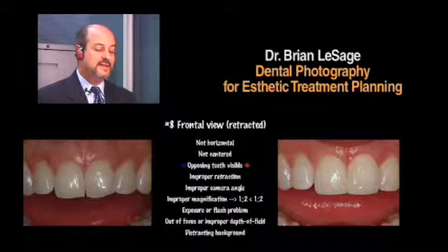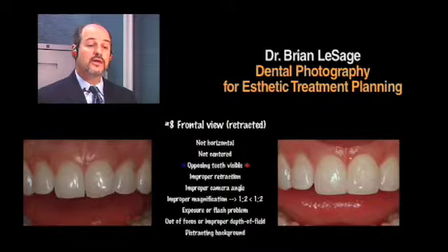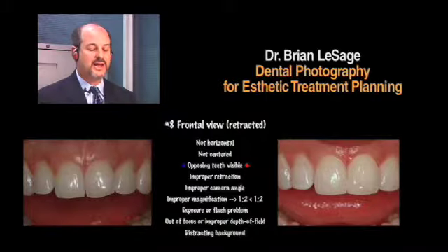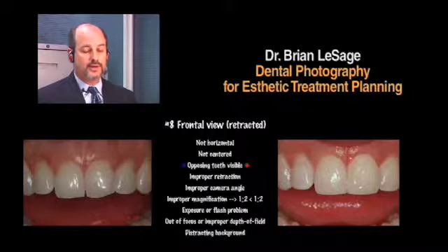Ideally, I like to see the incisal edge in the lower half of the slide film. So, you know, between here and here, the lower half. You can see I'm slightly in the lower half. I'd probably like, ideally, this to be just a little lower, but that's not that crucial. Just as long as you can see gum, okay, the gingival tissue, then we're okay, all right?